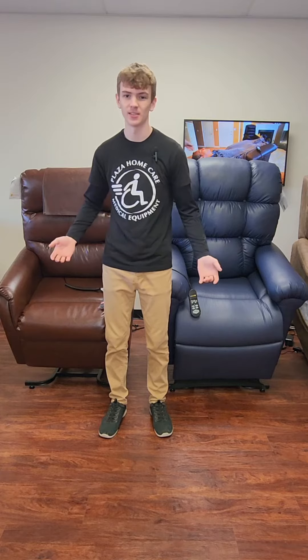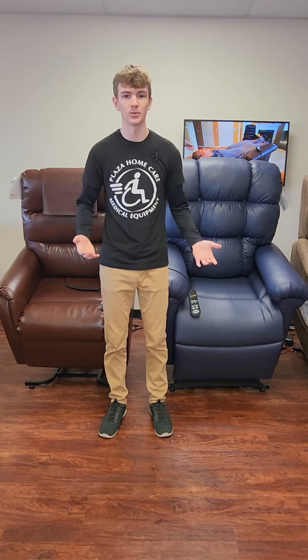Hi, I'm Elijah with Plaza Home Care, and today I'll be going over the importance of lift chair features and sizes. There are many options and features for lift chairs, and the first I'll be discussing is the amount of motors. Lift chairs can have up to five motors, and the more motors you have, the more control you have over the chair, which allows you to comfortably position it to your personal needs.